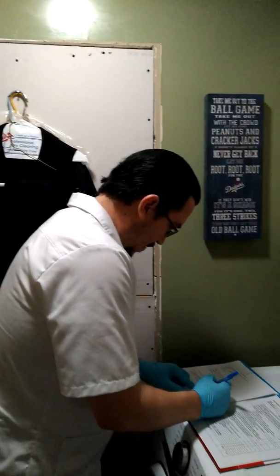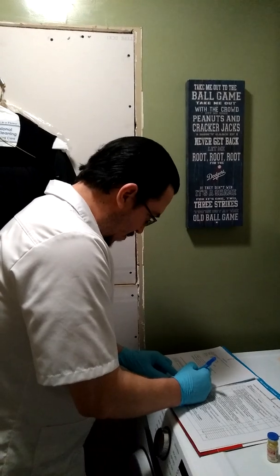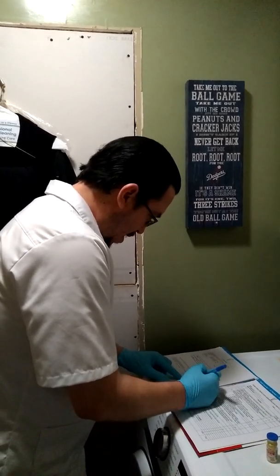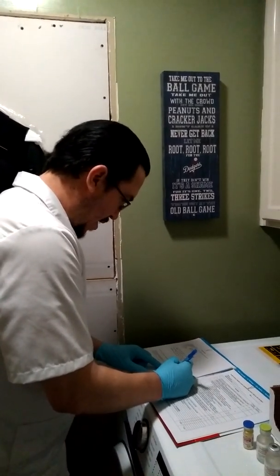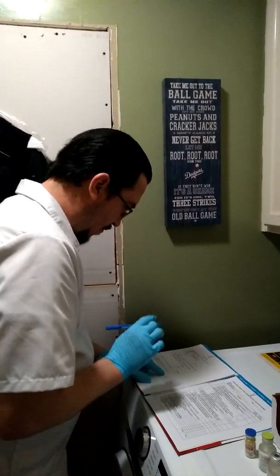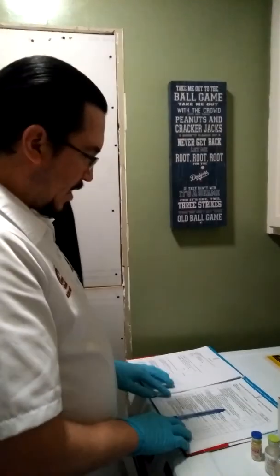Okay, I'm gonna perform a calculation to determine the correct amount of medication. The doctor gave me a vial of 2.5 ml. He told me to give him 1/5 of it. So if I do the math, it comes down to 0.5 milliliters. So I gotta give the patient 0.5 milliliters. Okay. For the appropriate syringe, I'm gonna use the 1 ml, 1 cc syringe with a 1-inch needle.